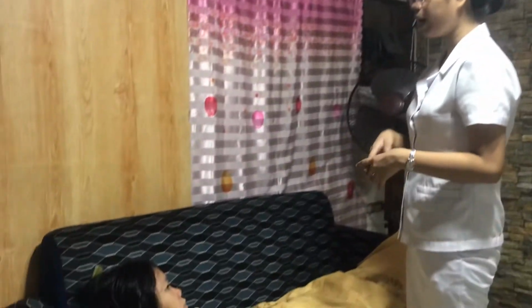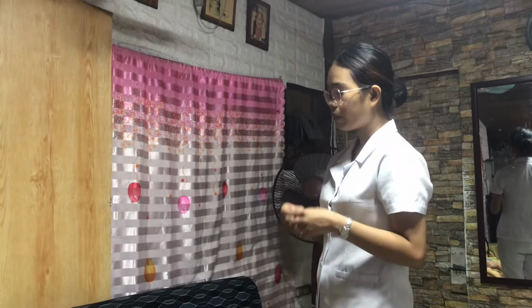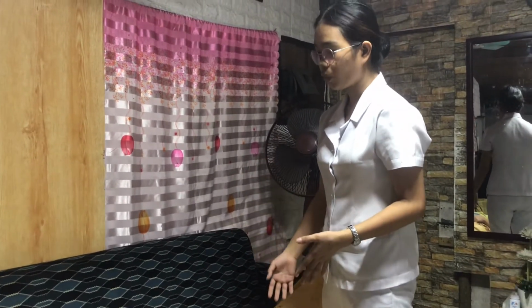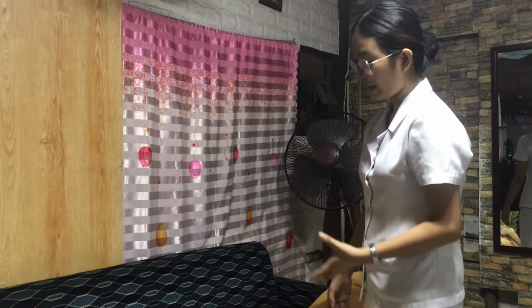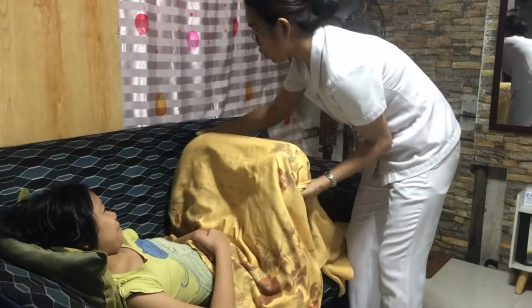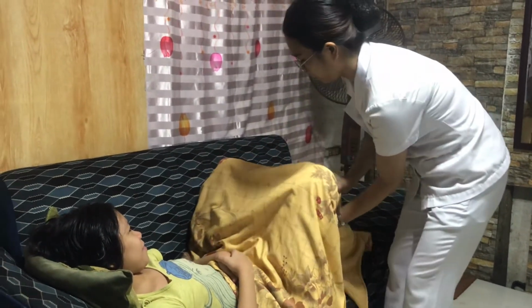So good day, ma'am. Since I already explained to you what we're going to do, the first procedure is that I will be putting the bedpan and the draw sheet under your buttocks, and then I will be covering you with a bath blanket. Is that okay with you? All right, that's good. So I will position you, ma'am, your feet.